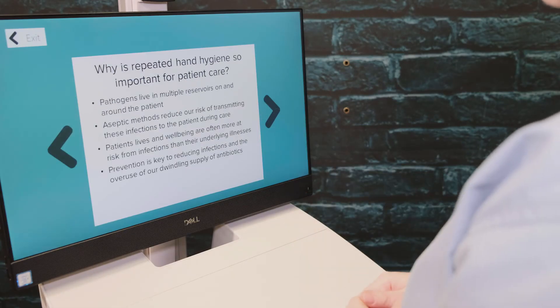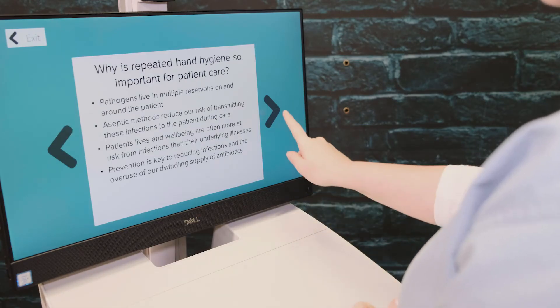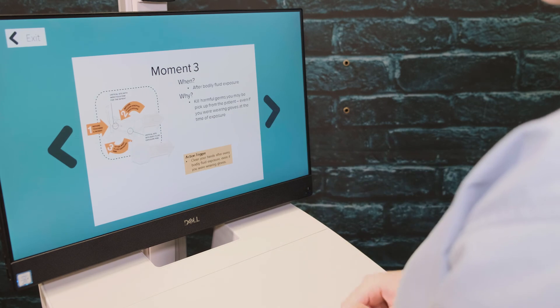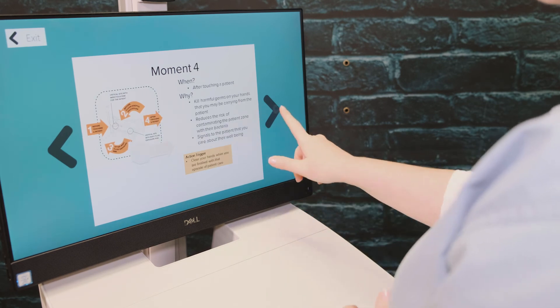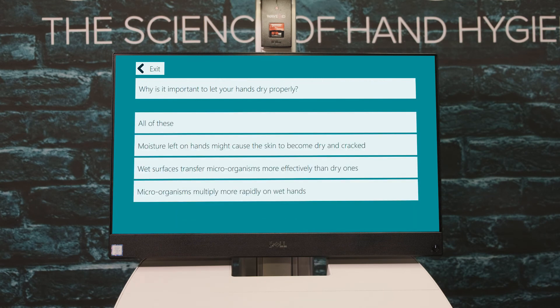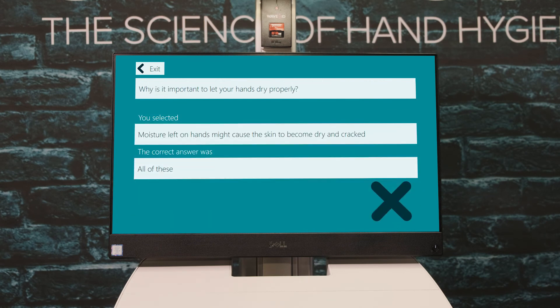The lesson feature provides quick, sharp bursts of learning. Both the quiz and lesson features are particularly beneficial in an outbreak situation, to ensure that users are knowledgeable in subject areas needed. In the quiz feature, questions are multiple choice. Once you choose an answer, the correct answer will appear on screen.